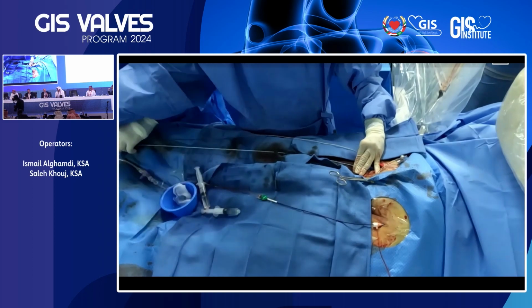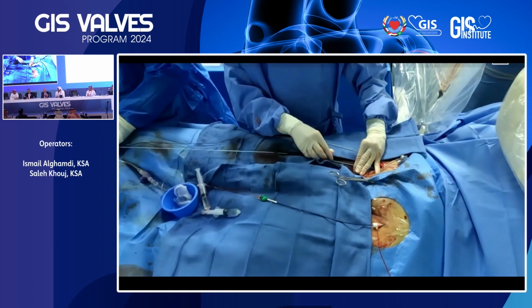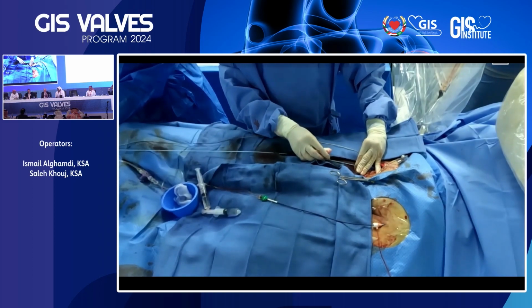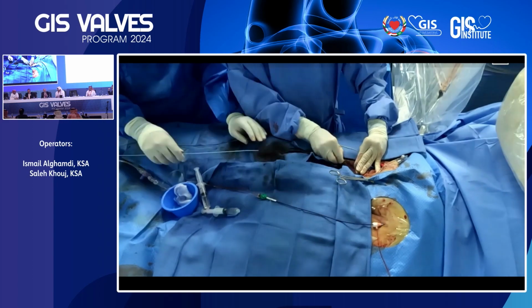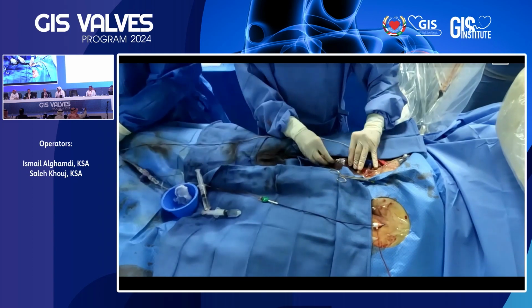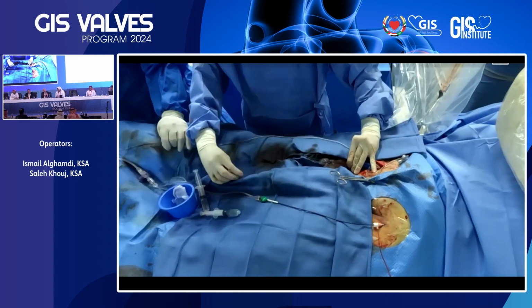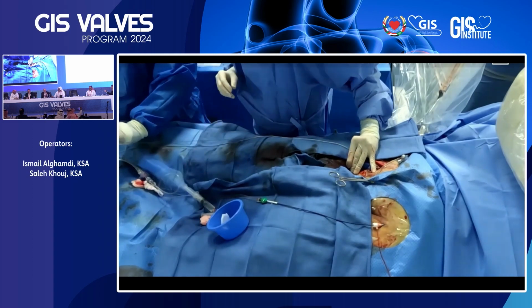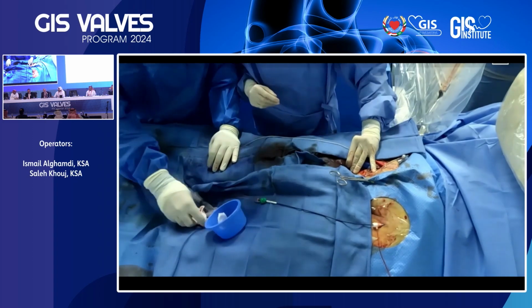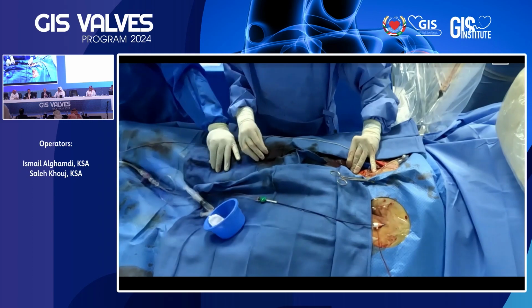There are two major possibilities. One of them is concentric remodeling. Small ventricle, the mass is the same, the thickness of the ventricle is the same, but the ratio of the wall is increased. You have a small cavity, and that means a low filling, which gives you this type of impression.